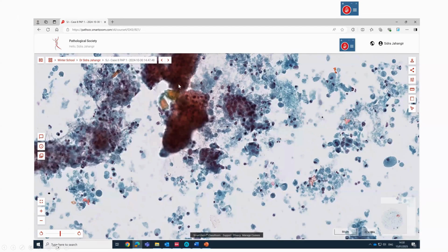Again, well differentiated. Maybe these are just GI contaminant epithelium, a monolayered sheet with ample cytoplasm. But these are the tumor foci, which show maybe discohesive cells, if you can appreciate these cells. They show very irregular nuclear membranes. The NC ratio is disturbed. They are discohesive, easily broken down from the tumor, with some overlapping and some pleomorphic cells here. So considering all the features, we are happy to call it pancreatic ductal adenocarcinoma.